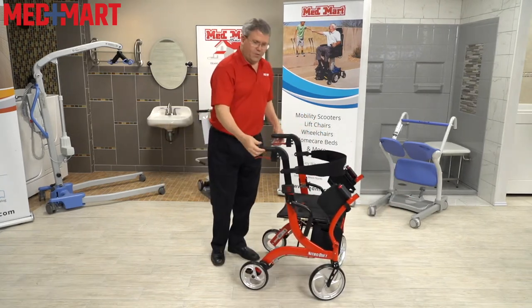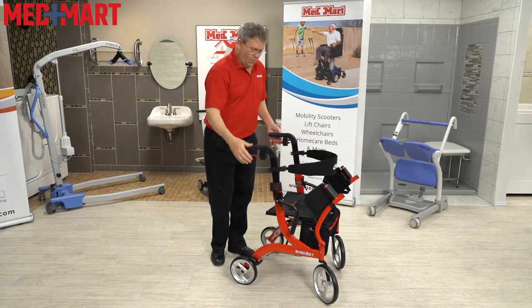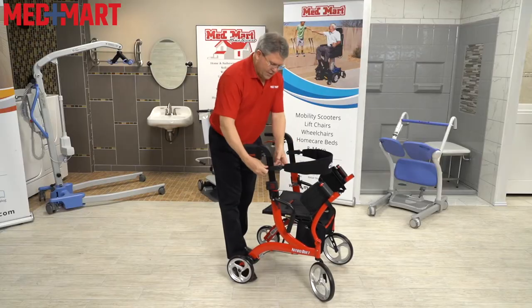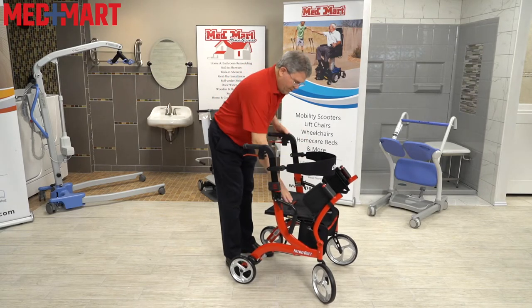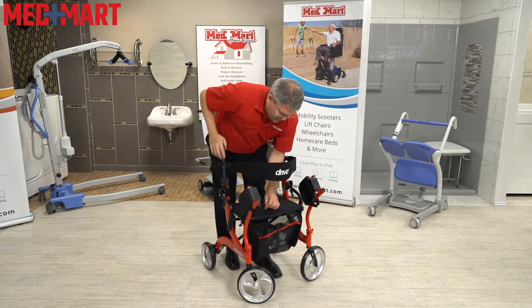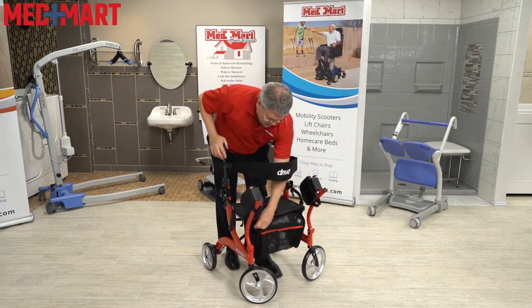Just like all the Drive Nitro walkers, they come with two brakes, so you can either lock them straight down or leave them up and squeeze them as needed to lock yourself in. It has a height-adjustable backrest, which adjusts without any tools whatsoever. Very comfortable seat. And a bag in the front, just like most of the Drive Nitro walkers, where you can put a purse, wallet, cell phone, or small items if you've been shopping.